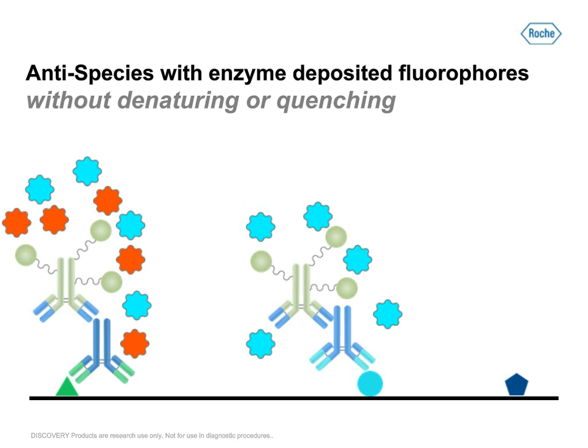And the same goes for anything done in sequence after that, and you can see here where you're just ending up with a mess of colors that shouldn't be deposited where they are.